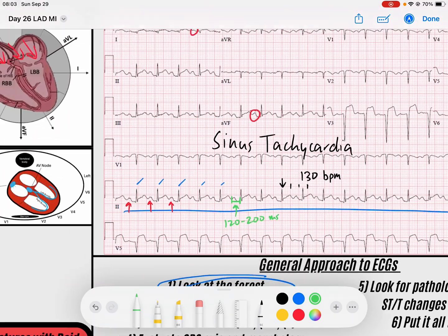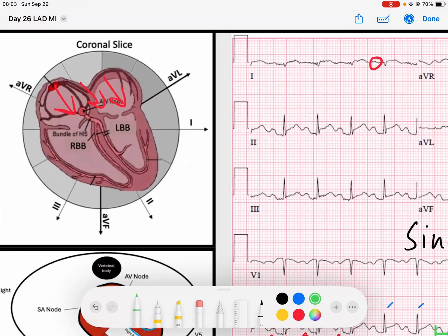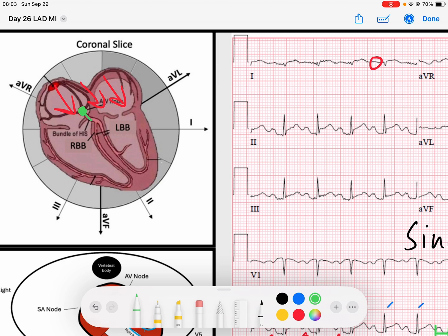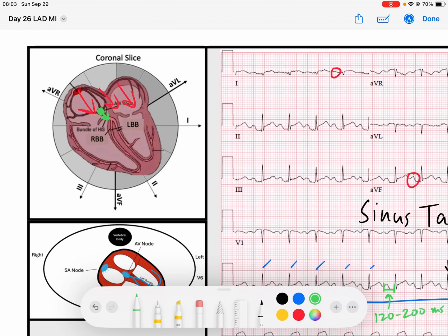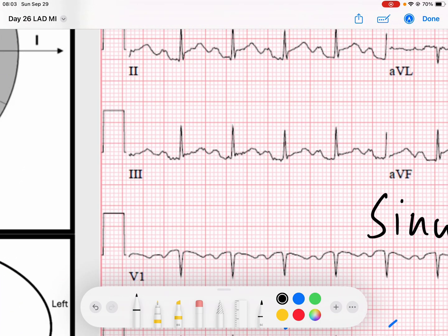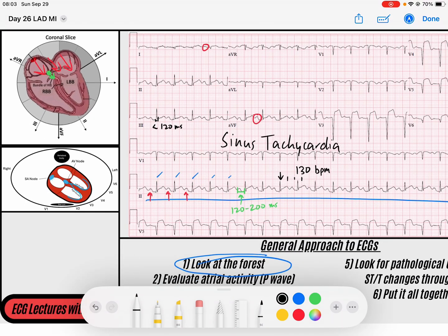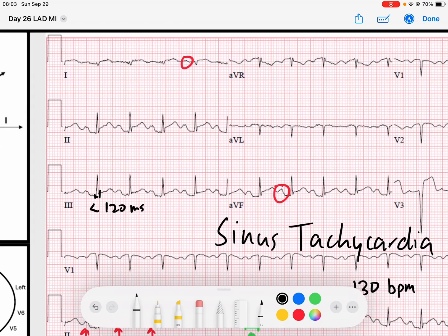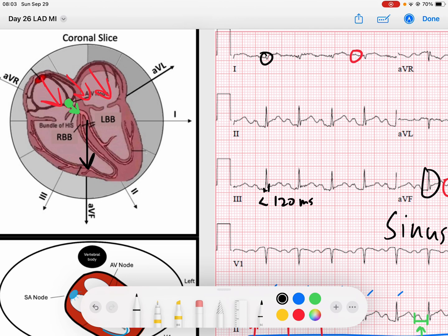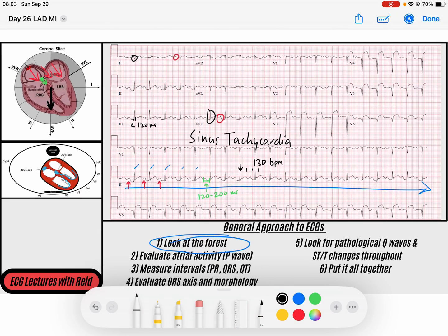Once the AV node captures that signal, delays it, and sends it into the ventricle, it's our job to look at the QRS complex. We said the QRS is narrow — less than 120 milliseconds. My QRS axis: it's maybe isoelectric in lead I but upright in AVF, so it's a little bit on the rightward side of the axis — almost a right axis deviation, but not quite.